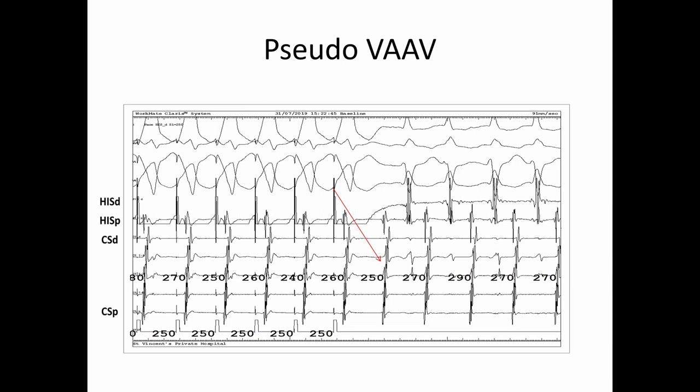So this is actually not atrial tachycardia. This is more in keeping with, you know, AV NRT or AV reentrant tachycardia.